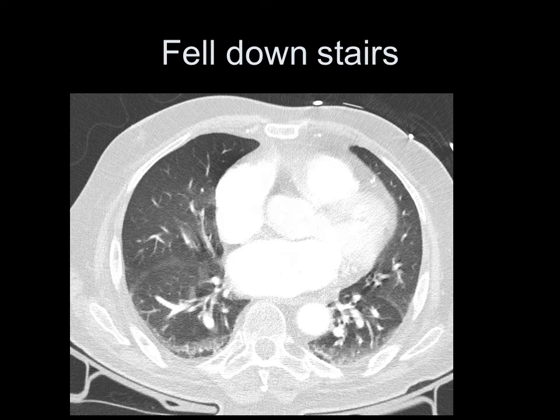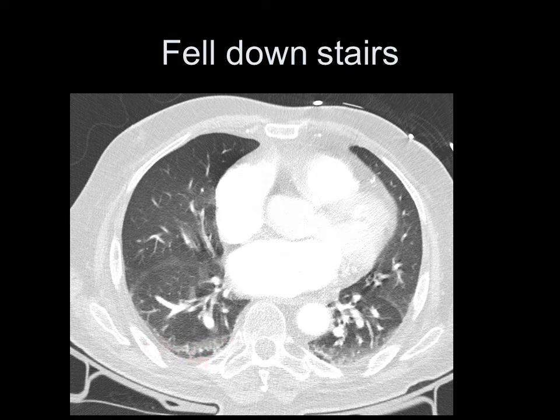Here's a patient who fell down the stairs — now it's becoming slightly more pronounced. Is this dependent change or something more? Is it moving towards atelectasis? We can see some normal black lung tissue in between the area of interstitial change. Interstitial change is an increase in density of the lung parenchyma without disturbance of the underlying architecture.